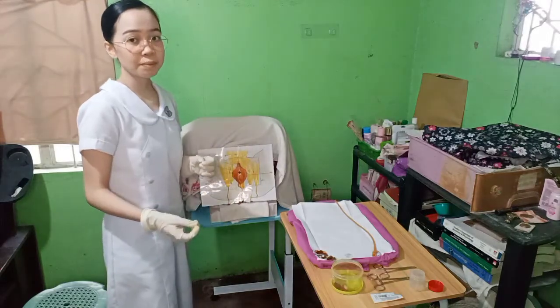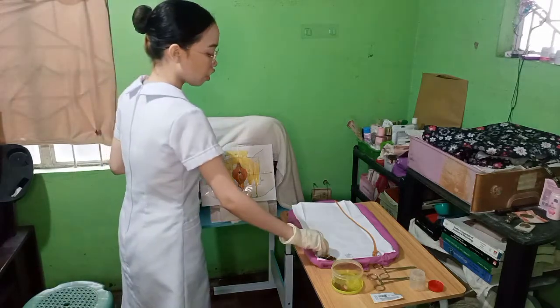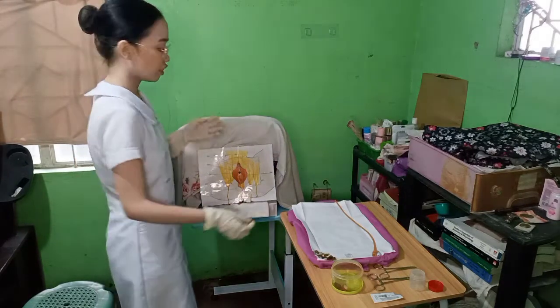And then lastly, apply a last single downward stroke from the urinary orifice to the anus to prevent complication in the vaginal inlet.